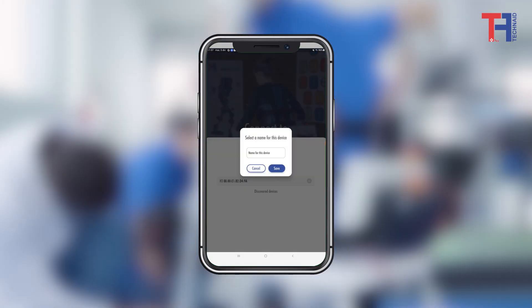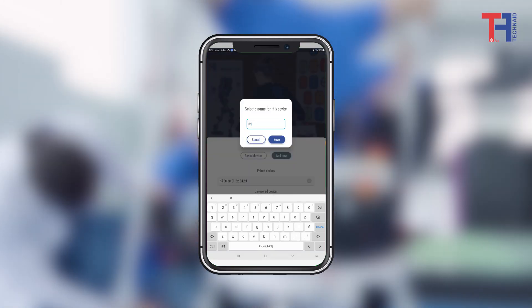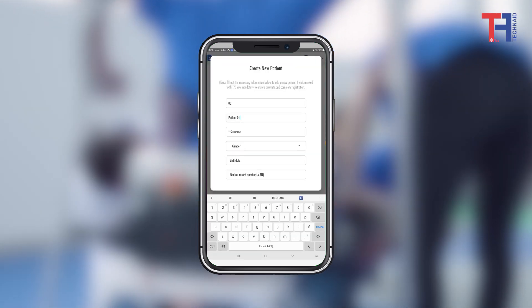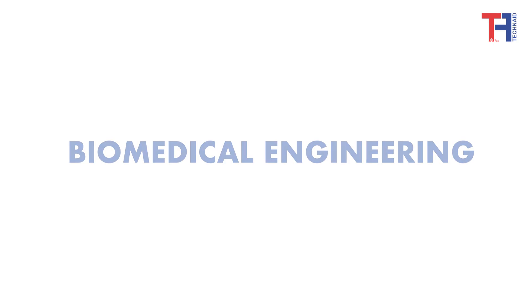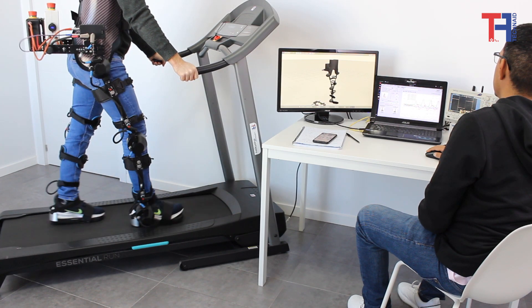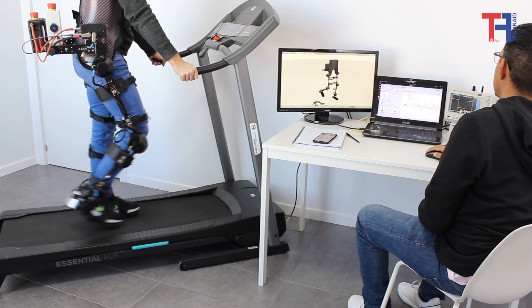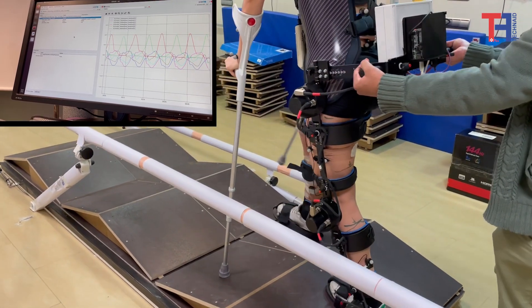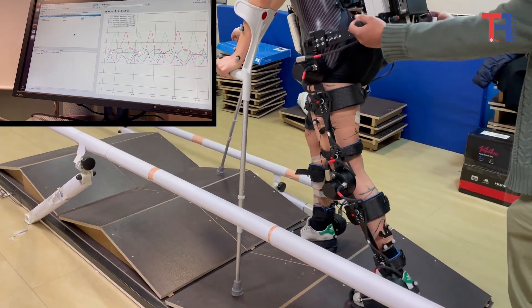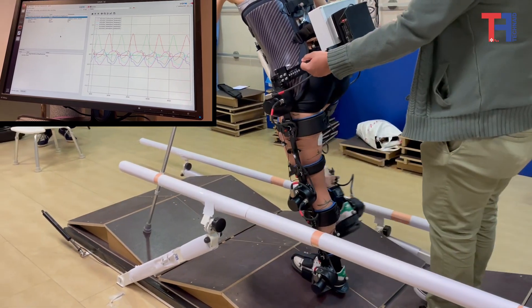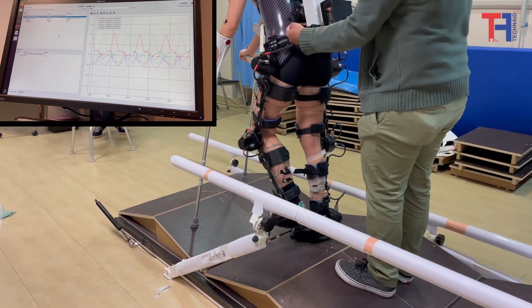All this through a simple Android application, which allows clinicians to focus on analyzing the subject's performance. For biomedical engineering, the device allows low-level control through position, speed, or interaction controllers. With the information obtained from integrated sensors or third-party equipment, it is possible to close control loops in real time.